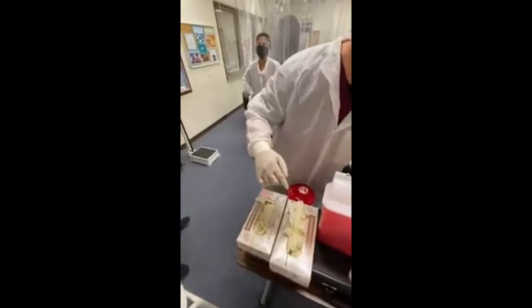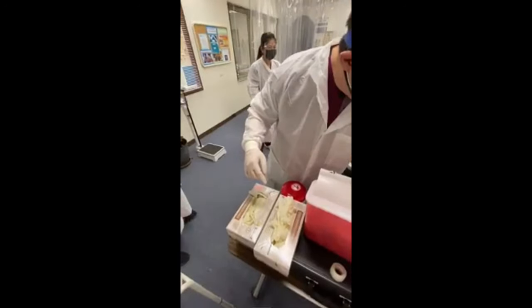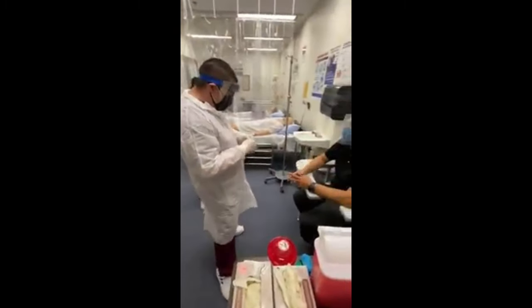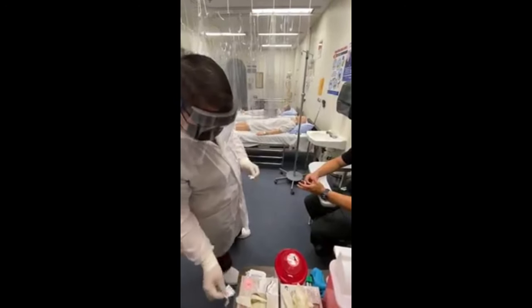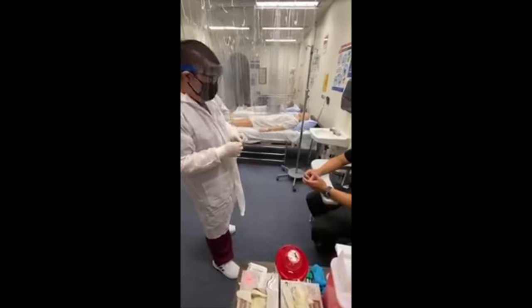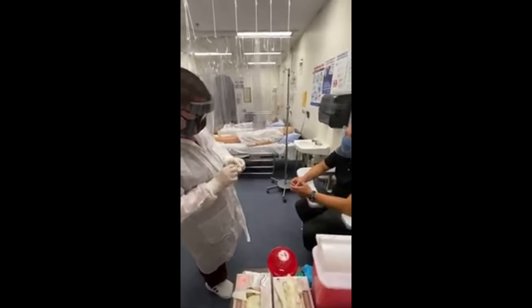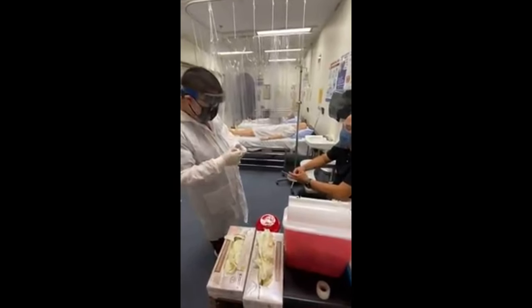Okay, so there's an alcohol pad. Sometimes some of the patients are very keen on how you move around as a phlebotomist, and sometimes they'll ask, oh, is this your first time doing this? They'll ask questions, and sometimes we kind of mess with them in a way, to the point where they don't want us no more. But it's just maintaining that atmosphere, like we're just joking around.